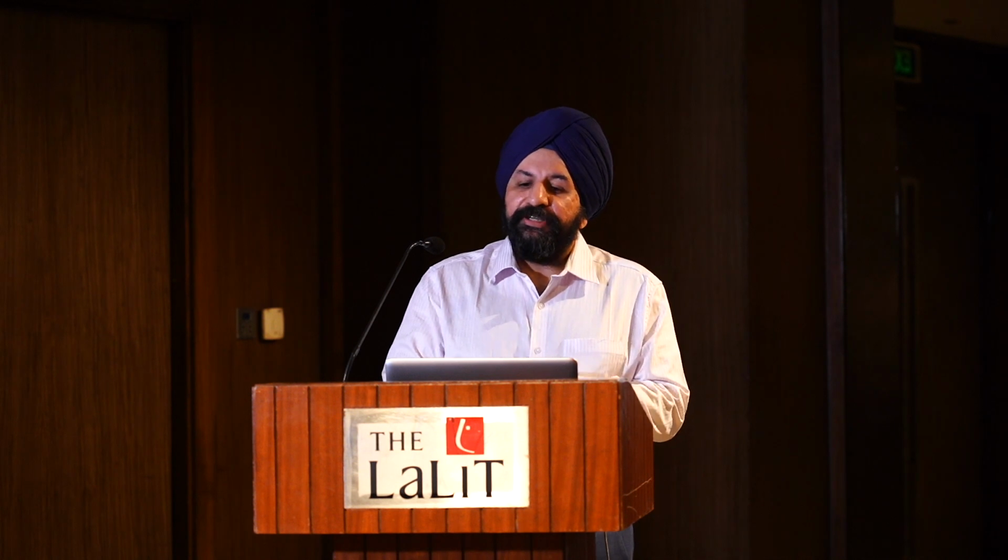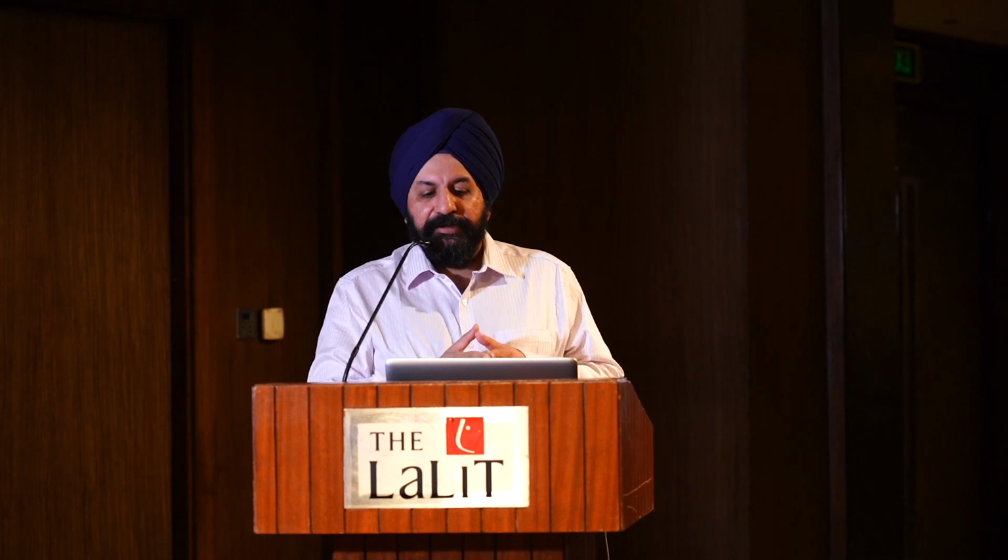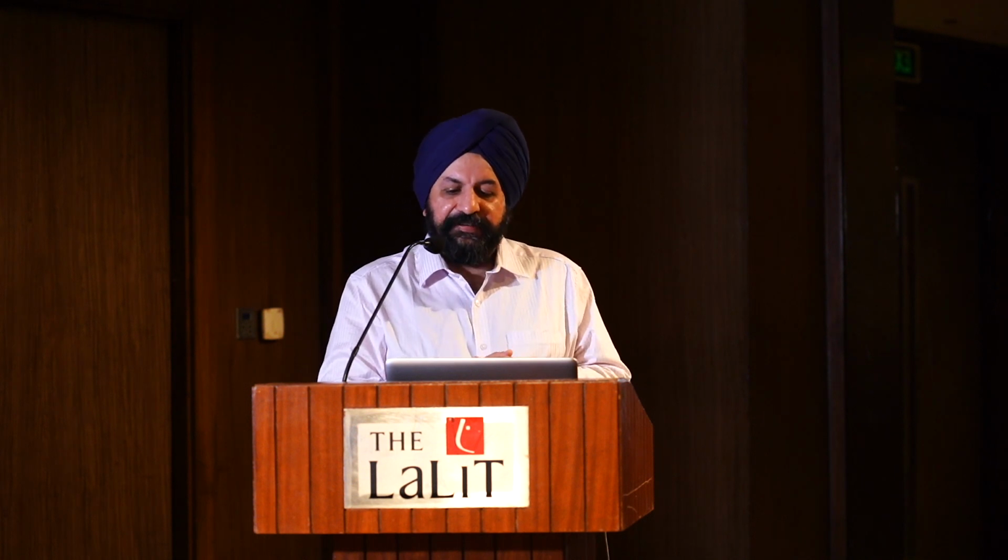Next, coming to the WBC parameters. Now, immature granulocytes is something that the machines are giving numerically. This includes your promyelocytes, myelocytes and metamyelocytes. The biological reference interval that we established in our lab is 0 to 0.7. Again, it can vary from lab to lab. You have to determine your own reference intervals.